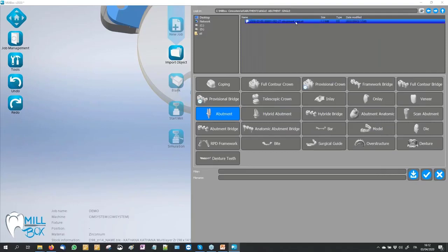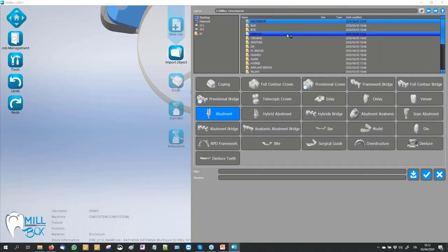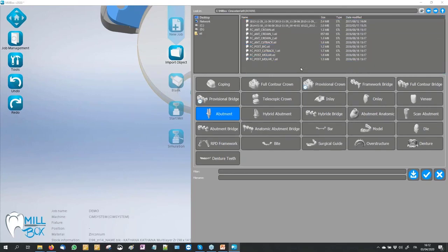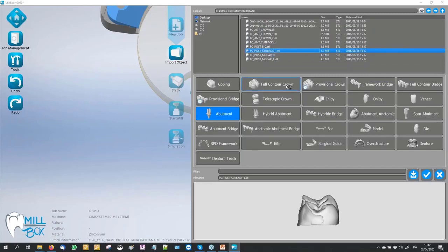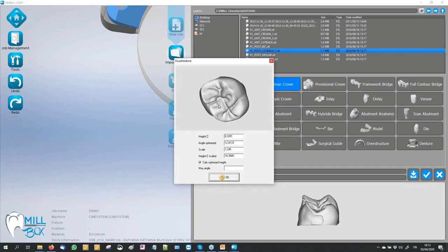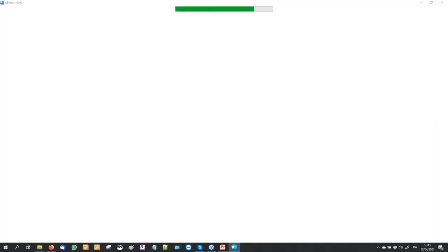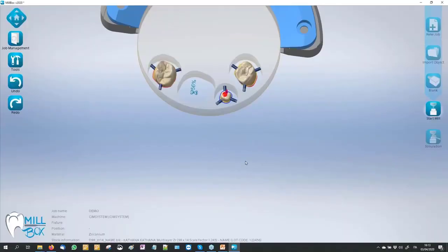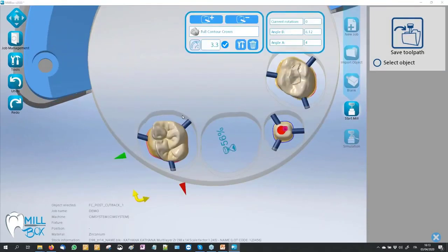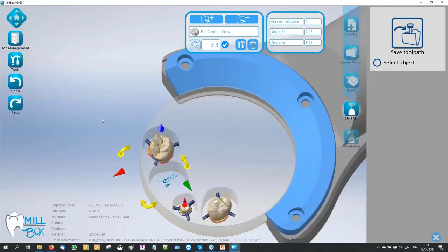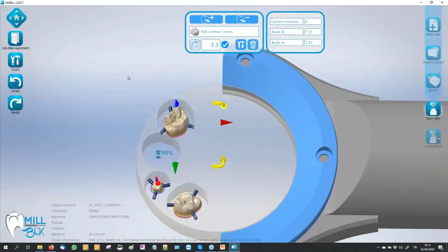I go to bring another object — a crown with a cutback. I select anatomic because here I have the anatomy in the occlusal part. Maybe I can also use another cool tool to mill this object.